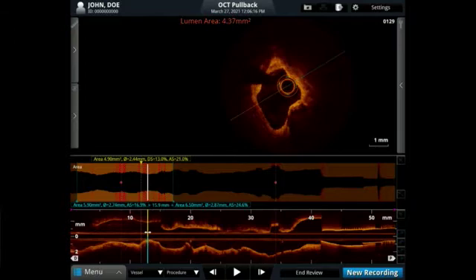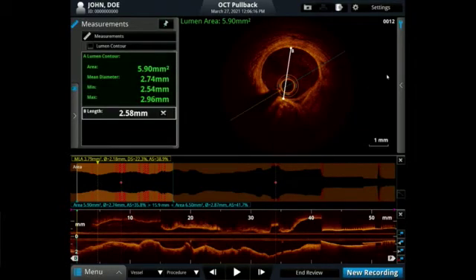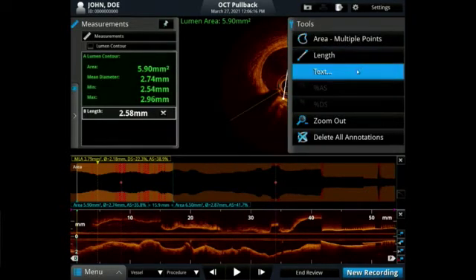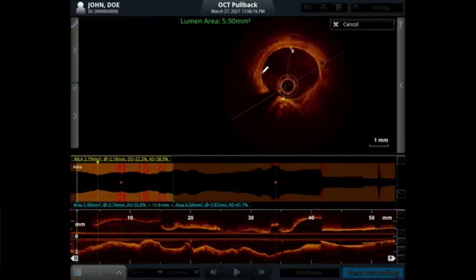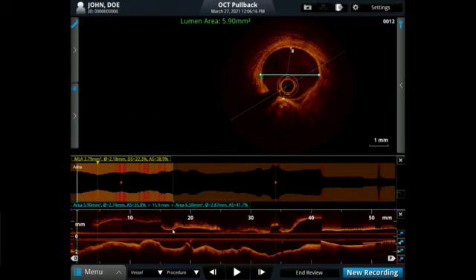Beautiful. The other important point you have to bring up here is that perforation, abrupt closure, no reflow, 0 with this technology, in the pooled analysis of 628 cases in our trial. You're not going to see that with the other technologies you thought you were going to use at the start of it. Give me 3.20 plus, so make sure you do long enough. Yes, I will do long enough, Dr. Morse. I'm with you.